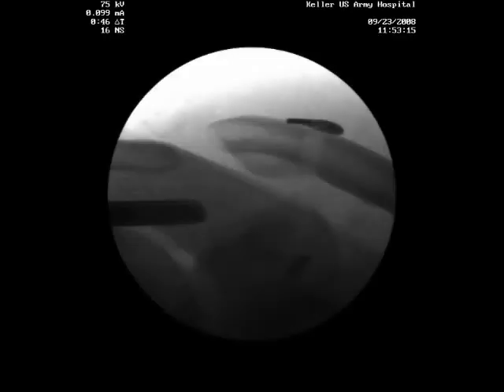Here's the final fluoroscopy AP view of our reduced acromioclavicular joint with a modest distal clavicle resection and the anatomic reduction back to approximately one centimeter of the coracoclavicular distance, with the shadow of our drill hole and the GraftRope implant in place.